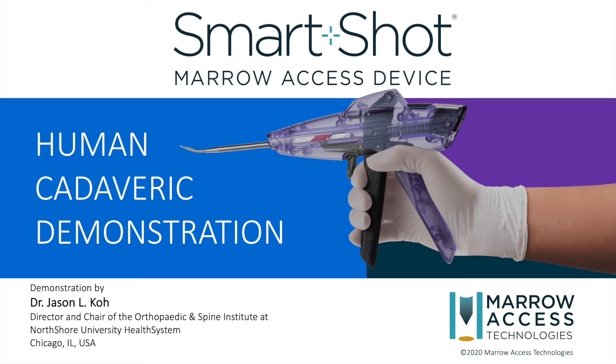In this video, Dr. Jason Koh of North Shore University Health System will demonstrate the use of the SmartShot Marrow Access Device in a human cadaveric knee.